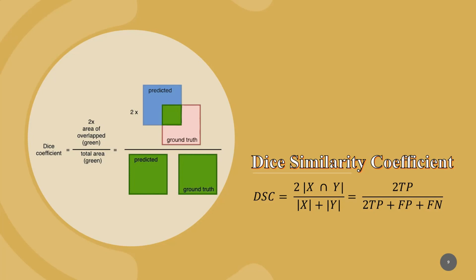We propose BCDU-Net V2, which is added to BCDU-Net to evaluate the network with two evaluation metrics, dice coefficient and IOU. The dice similarity coefficient is commonly used to calculate the similarity of two images. Of course, it can be used for any other type of data. This is also one of the main metrics for evaluating the result of medical image segmentation. This value indicates how similar the results of the segmentation model are to the actual ground truth mask.